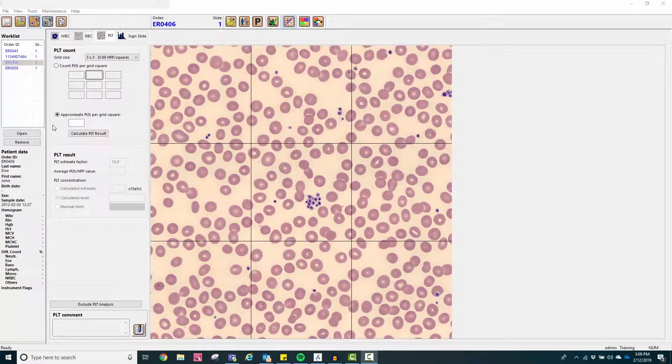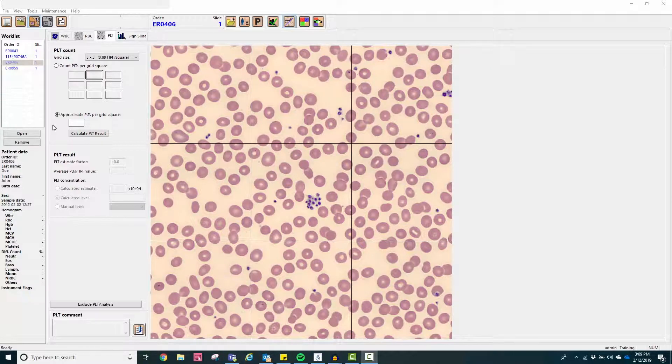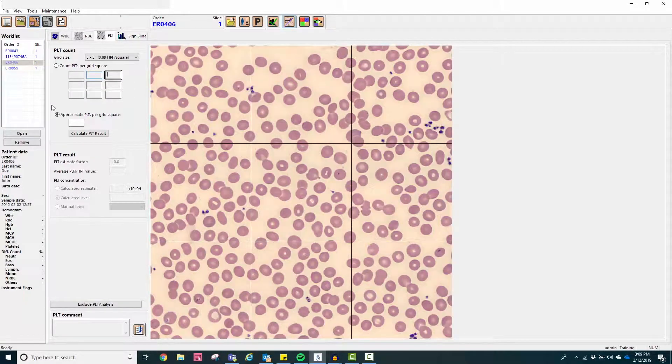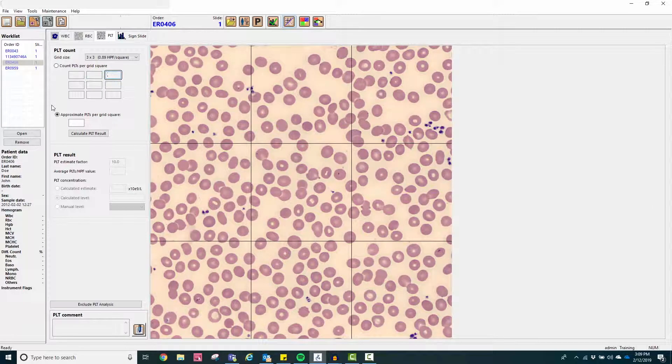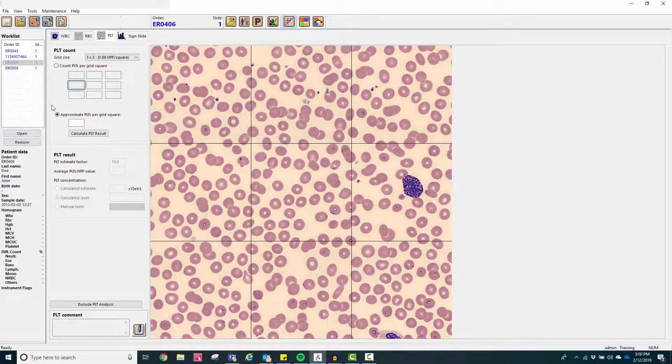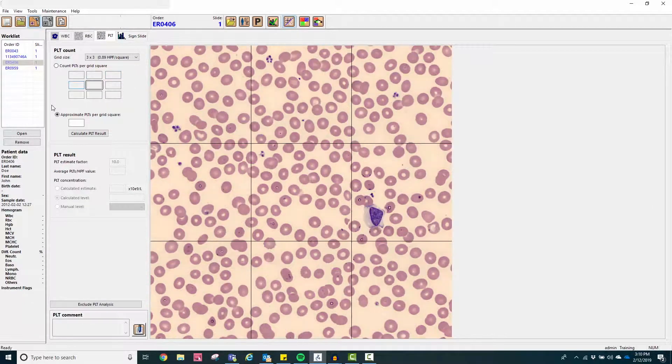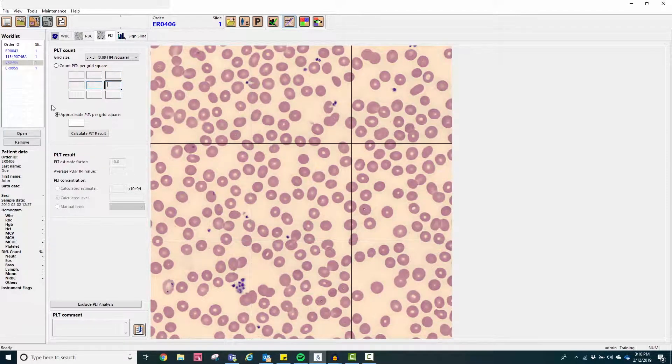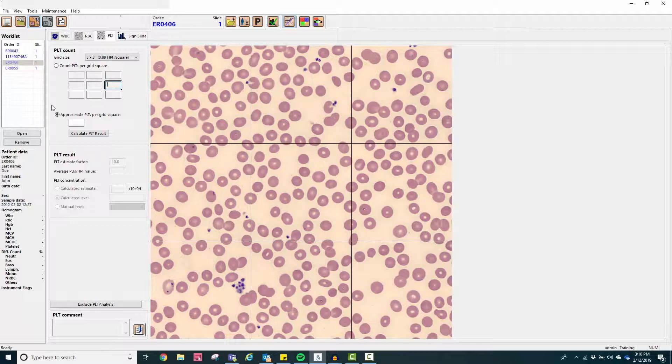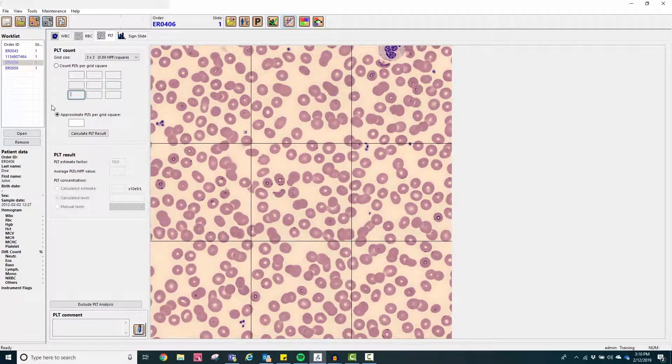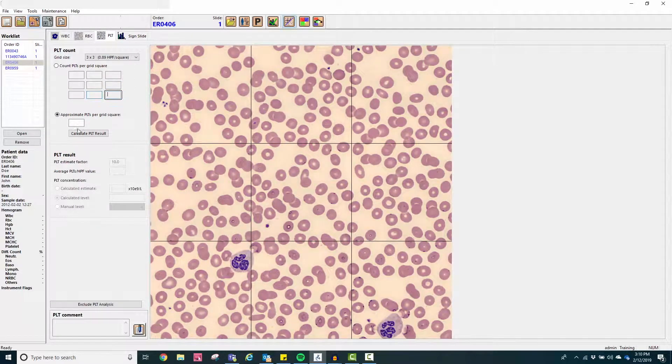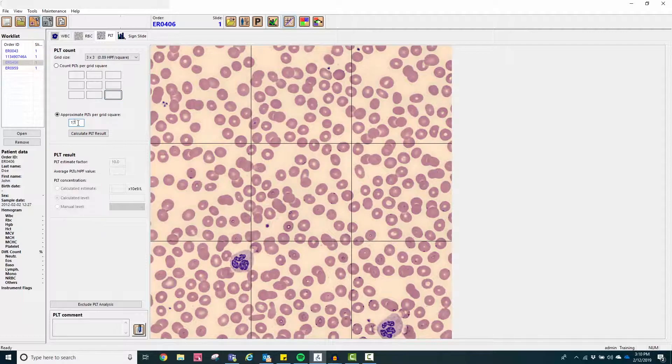Platelets may be manually evaluated directly on the system from images obtained by the system. This allows for the rapid identification of abnormalities including platelet clumps, large and giant platelets, and allows the technologist to include a platelet assessment and save it on the system.